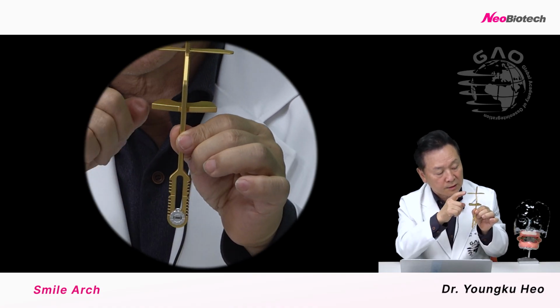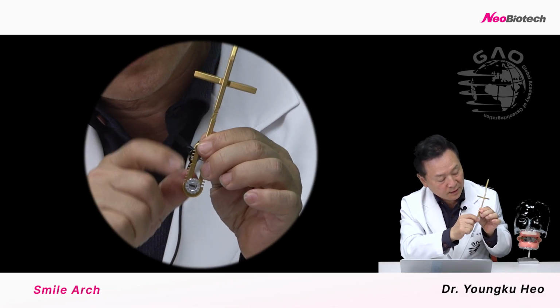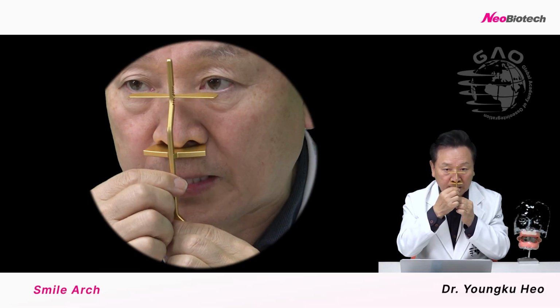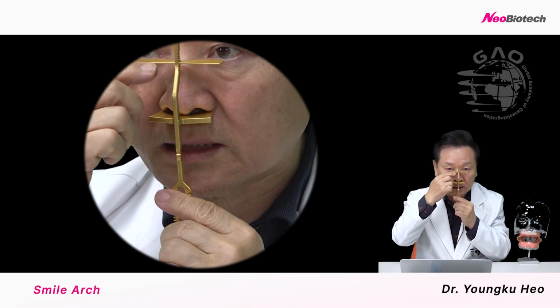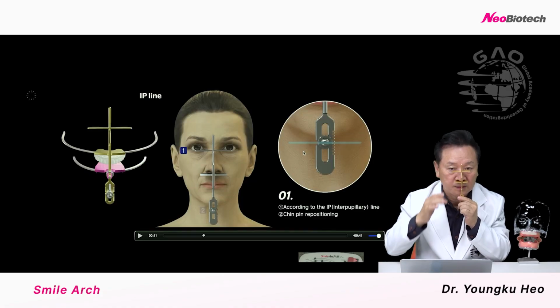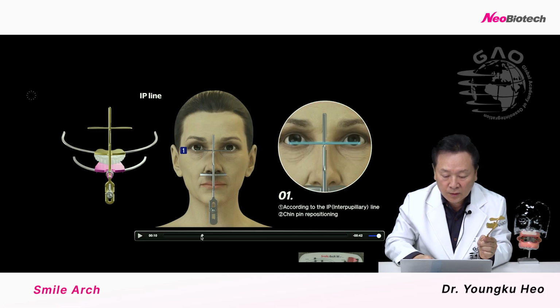So we call this the main bar of the SmileArch. There's an A point, a B point, a C point, and a D point. If we put this at the patient's subnasal point, we can see the interpupillary line. This is the standard A point. So what's the difference between them? As you see here, this is 1 millimeter above the standard line.